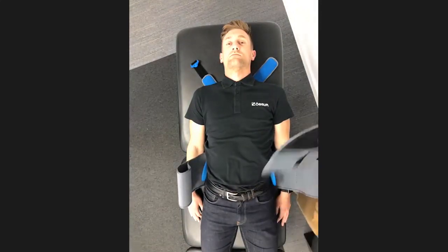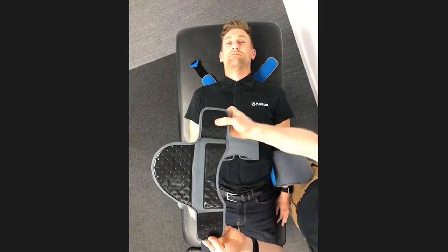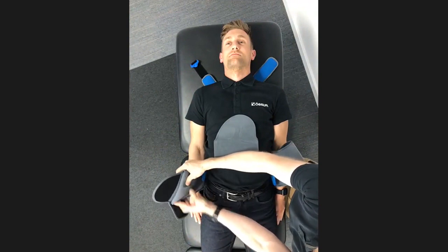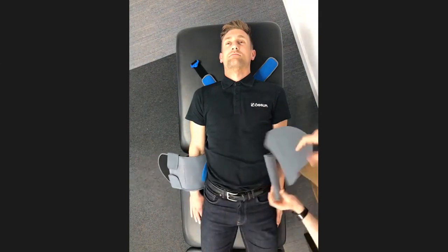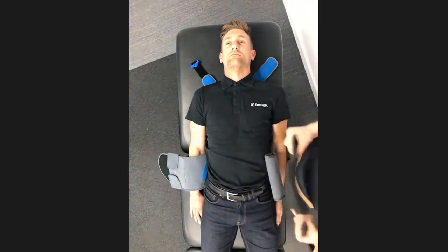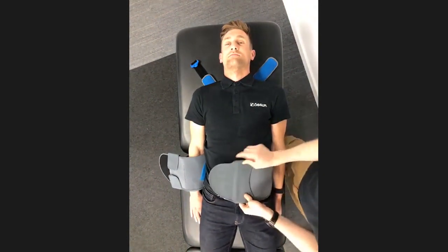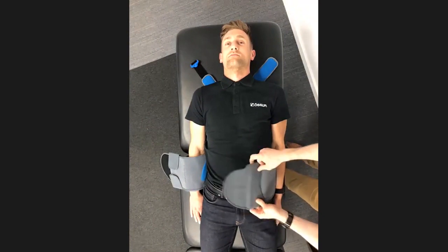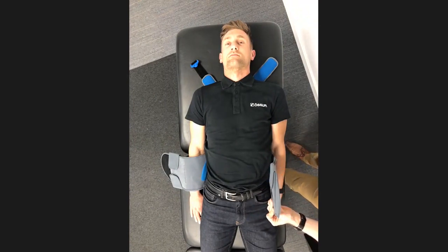and we can then add these two tabs. I'm going to place that just there for the moment. And with these, you can see that we've got these Velcro sections, and we're just going to add it onto there like that. And we've got that positioned correctly. Add this one onto there, either side. And if you've trimmed these, if you wanted to trim those to get the most low profile fit, so we wouldn't have this extra layer there, it would give you a very low profile fit, but the trimmed end would actually be hidden in there. So it just means it looks very neat.